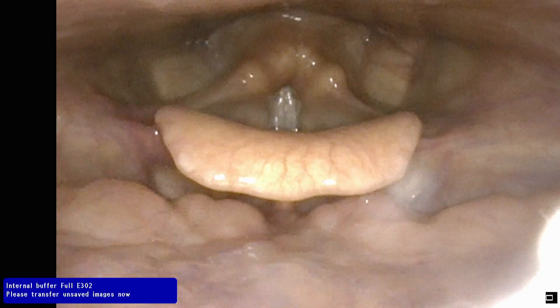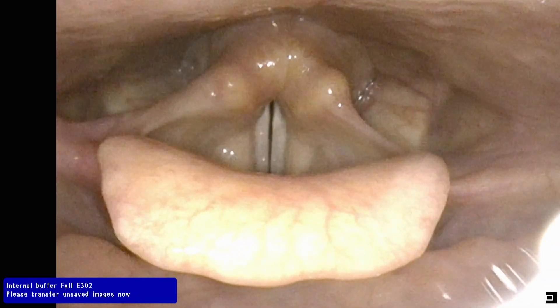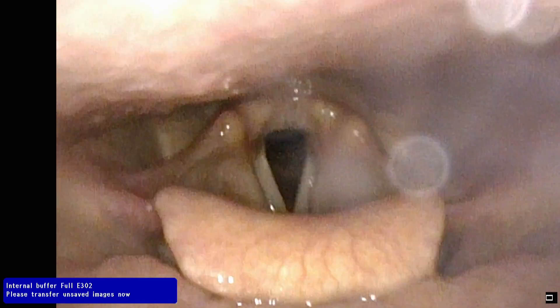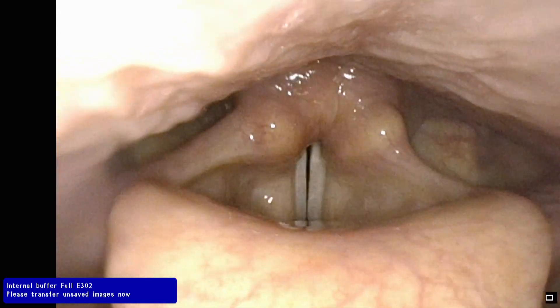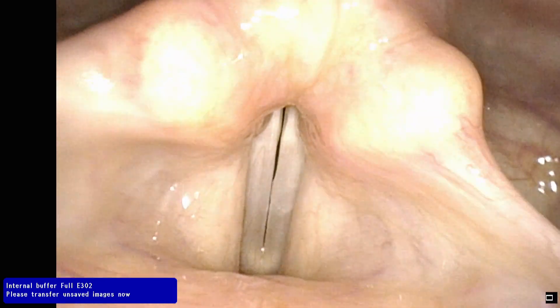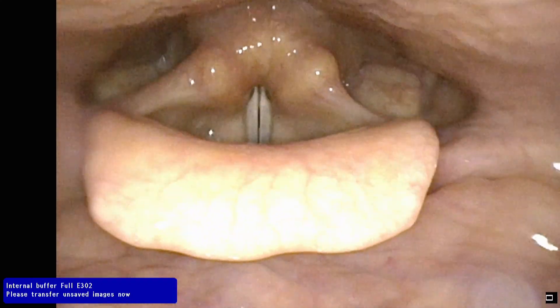Try to go just a little bit lower. It felt really strange. Yeah. Okay, let's do that again. The high-pitched E? Mm-hmm. Good. Okay, relax.